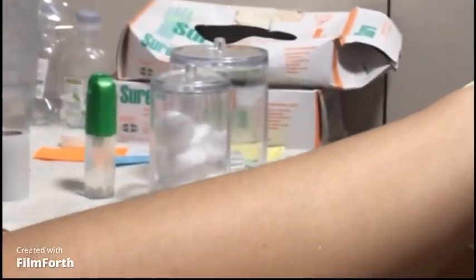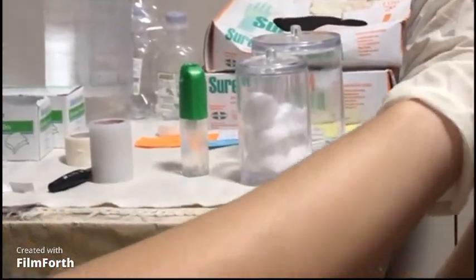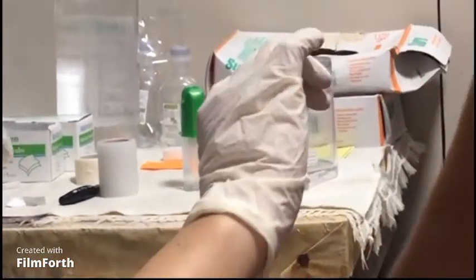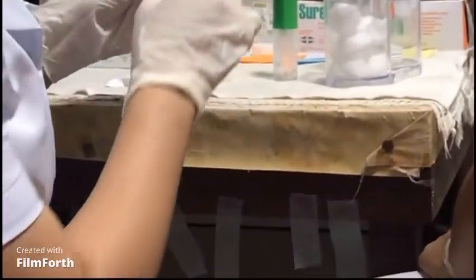Then transfer and hold the swab between the third and fourth fingers of your non-dominant hand in readiness for needle withdrawal. Position the swab on the client's skin above the intended site. Allow the skin to dry prior to injecting the medication. Then prepare the syringe for injection.